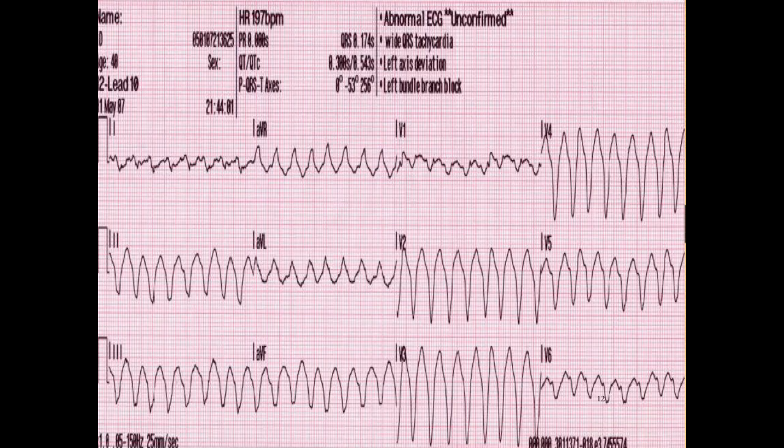So, circling back to my patient that I picked up at this community hospital, they've been treating her for 8 hours. They've been treating her with amiodarone. She kept going into these wide complex tachycardias. We said thank you to the physician, got her into our truck, ran a couple 12 leads when she went straight into a tachycardia with us, which was timed perfectly, and ran through all of these criteria and said she is failing most of these criteria. She is maxed out on amiodarone. She's been given lidocaine. It hasn't worked.